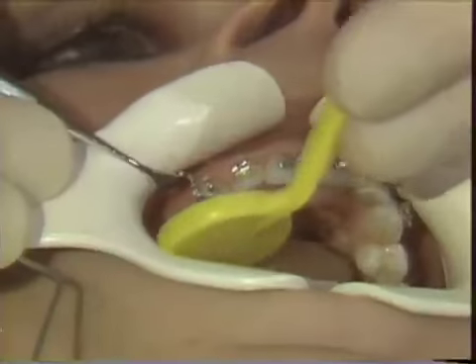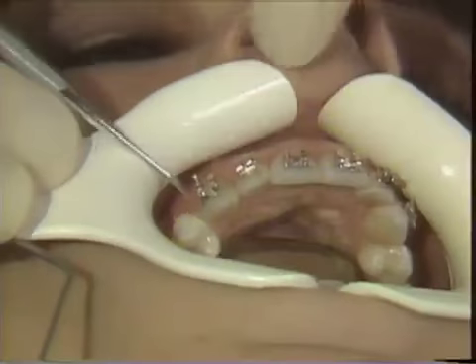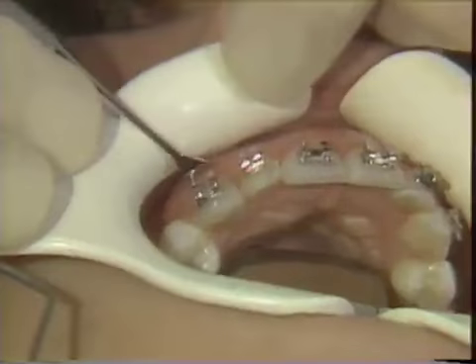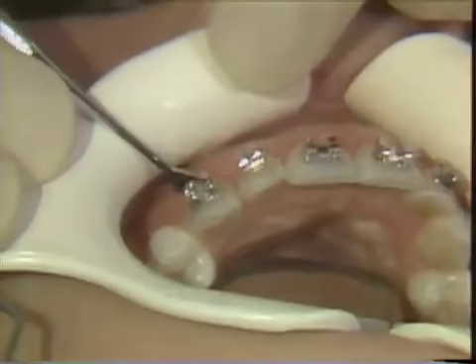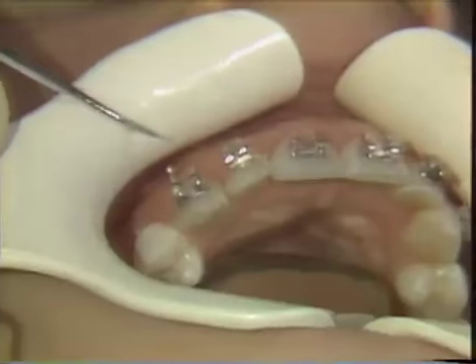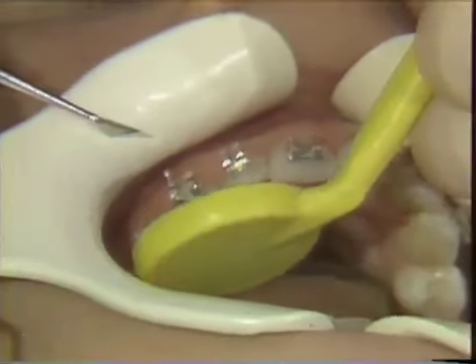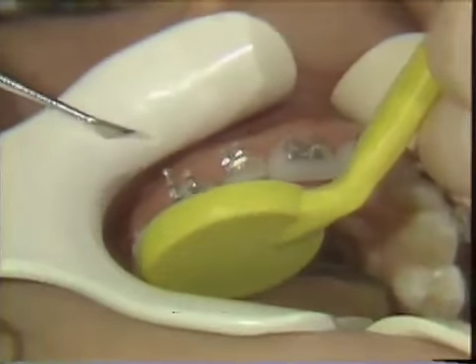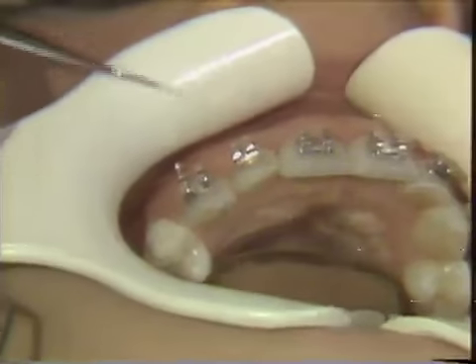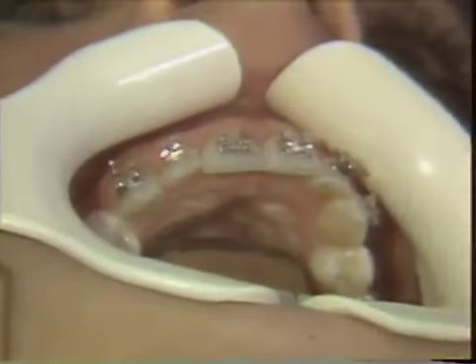pushing it in place after we have checked the position, and then we finally position it like so. And once again, final check. It's important to check to make sure that there are no obvious gaps being left, and if this were to be the case, those would have to be either filled in later or the bracket repositioned.